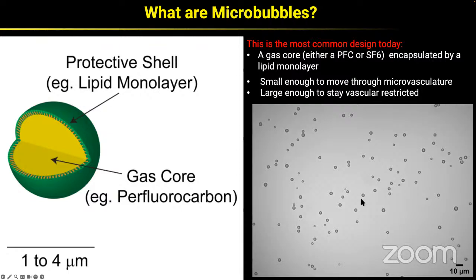And here, this is just a micrograph showing some of the microbubbles we've made in our lab. The big thing to note here is that it's actually a polydispersed population. So we get microbubbles of different sizes. So they generally tend to be less than 6 microns because the really big ones don't survive very long, but they can be submicron as well.